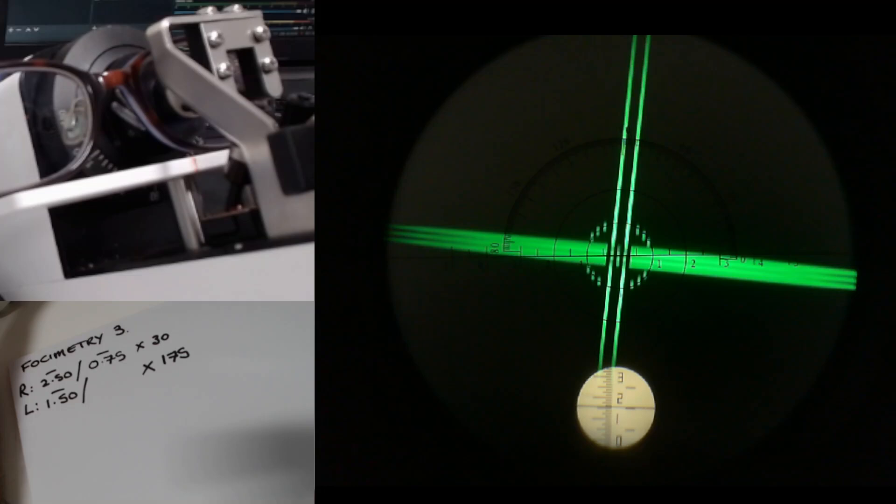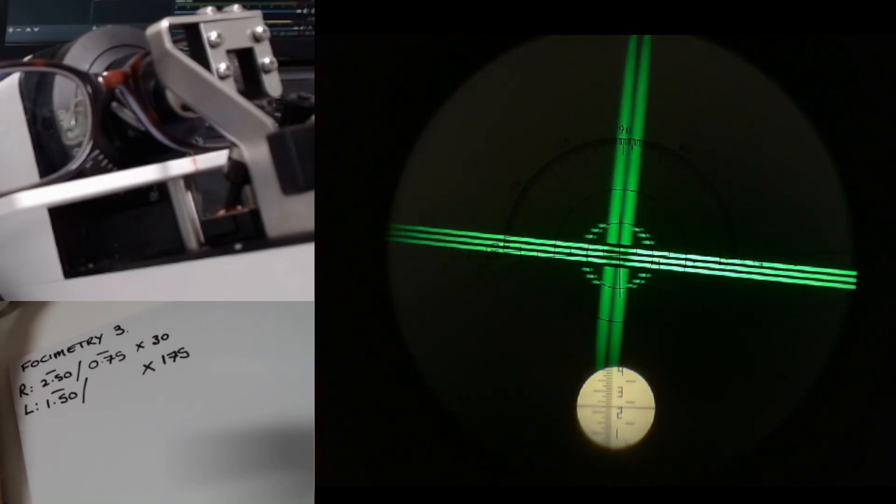You can see by the length of the little dashes in the middle that the cylinder power is quite low on this one. So it's going to be quite tricky to be accurate, but that's what the practice is all about. I'm just going to move that one a little bit more towards the minus.